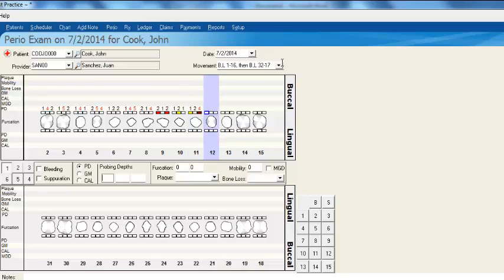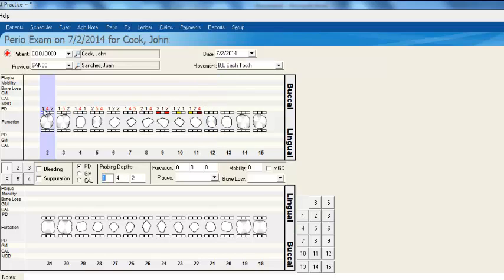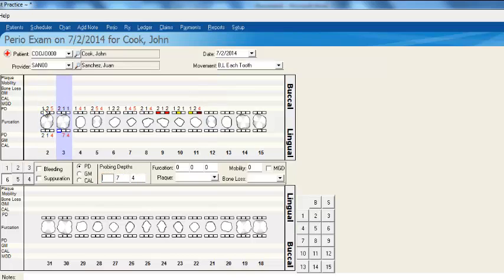If we choose a different movement — maybe recording each tooth by itself — and go back over here, you can see that we're now recording perio measurements tooth by tooth.